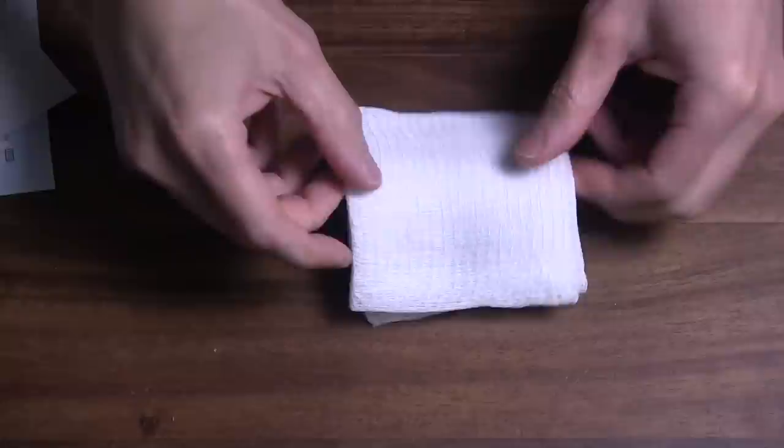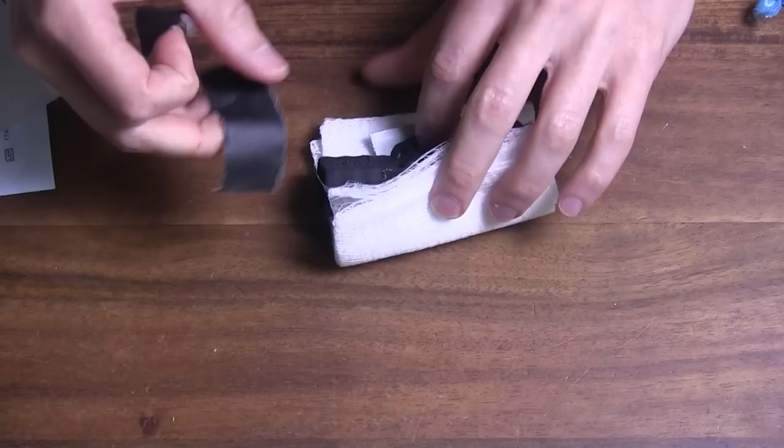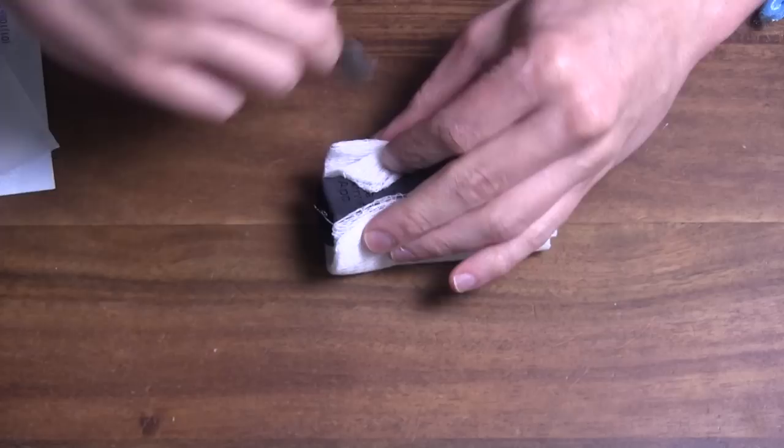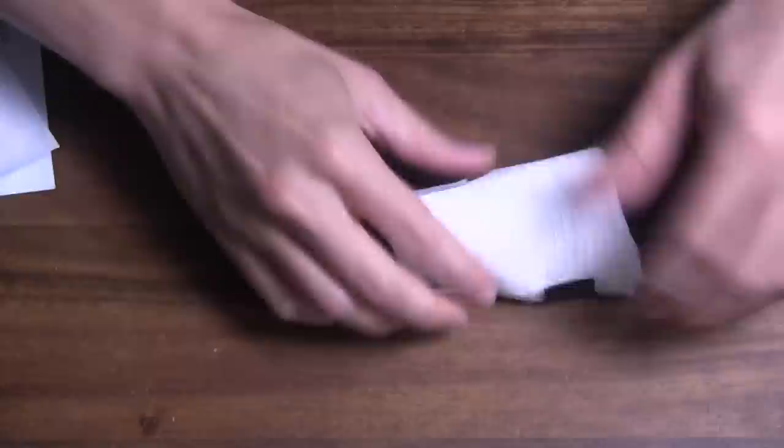Now, you don't need to tape these down. You could just leave it as is. I think it is a little bit easier to just throw some tape on. It kind of locks the soft tissue down. So we will now tape at the bottom and at the top. And now we have a nice, firm model with soft tissue on it.